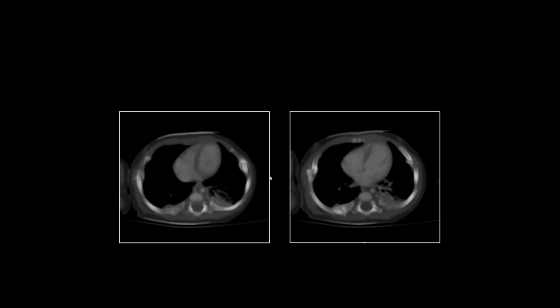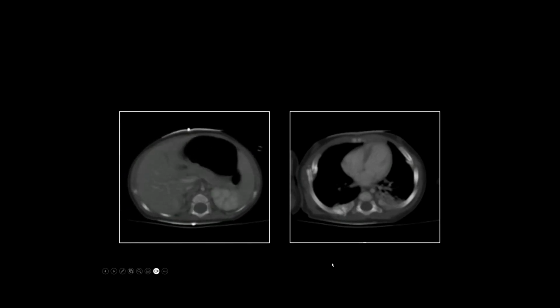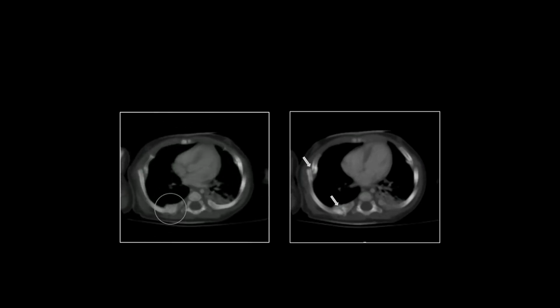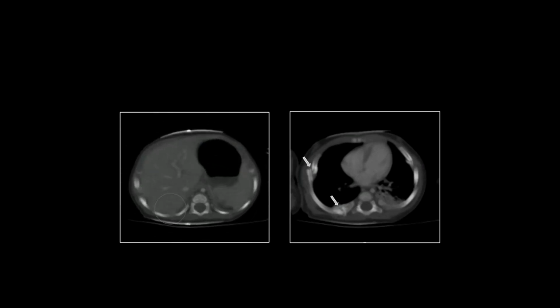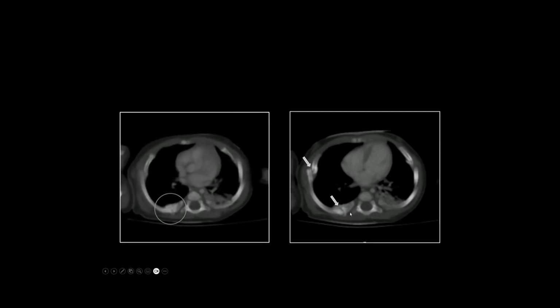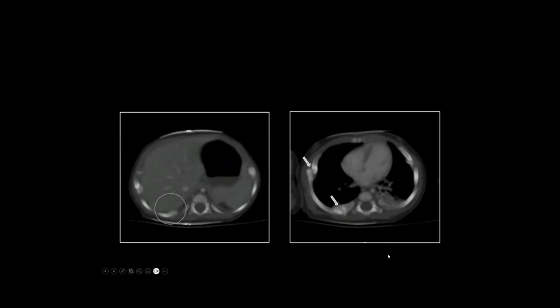And note this location. This is the posterior rib fracture that people are always talking about in abusive injuries, right? It happens right there because rib fractures from abusive trauma are due to squeezing. And when the rib cage is squeezed, basically the rib is pinioned against the transverse process. See that location? Right there. So it's something to do with the mechanics where the rib abuts the transverse process that it has a tendency to fracture right there.